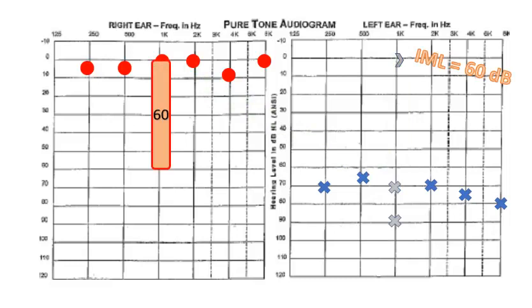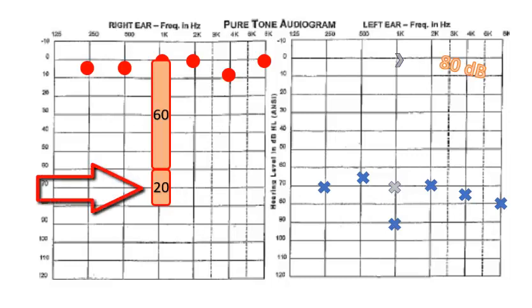After introducing the 60 dB noise and retesting, we see the threshold has now come in at 90 dB, a shift of 20. The optimized method protocol guides us to now increase the masking by the amount that this threshold has shifted. Since the threshold shifted 20 dB, we will increase the masking by 20 dB and retest. We now have a total masking level of 80 dB. When we retest in this case, the threshold has remained stable at 90 dB. We have a properly masked air conduction threshold at 1000 Hz in the left ear. Final masking level was 80 dB.